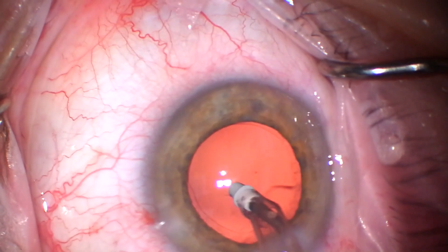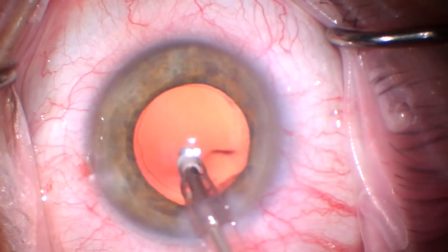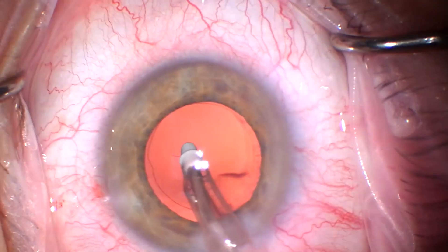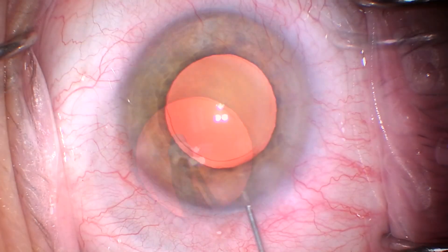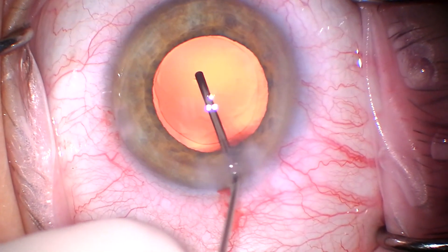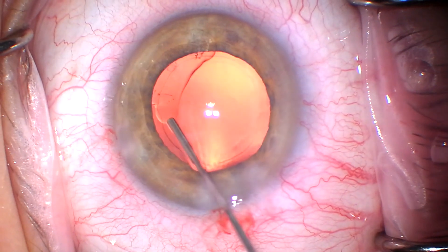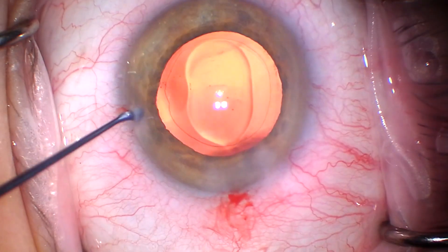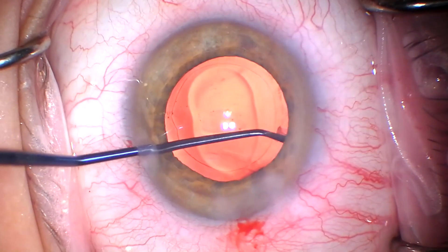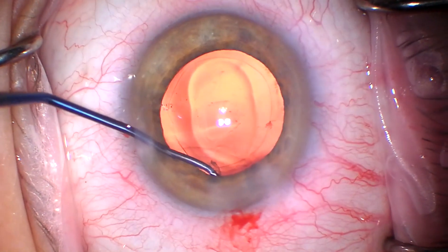Here we are polishing the posterior capsule. This tip is really good for this. I don't recommend doing this if you like doing YAG capsulotomies — I'm kidding. Fill the eye with ProVis. I really prefer to polish the underside of the capsule, but you have to be careful — you don't want to polish the back side of the iris. So I'm adding a little viscote there to kind of push the iris away. This is a titanium capsule polisher from Epsilon.